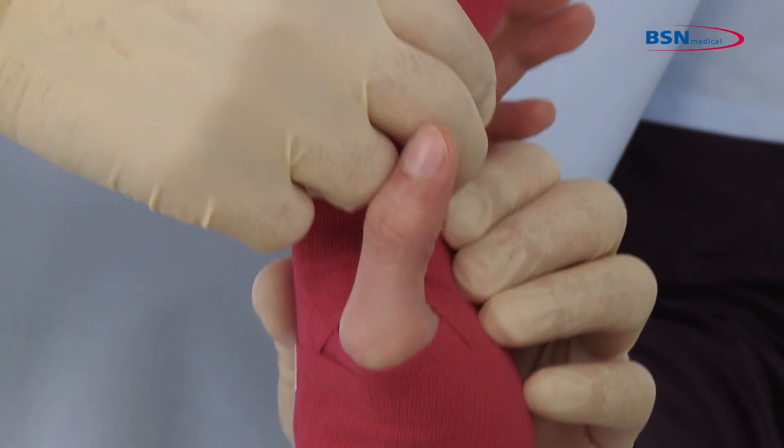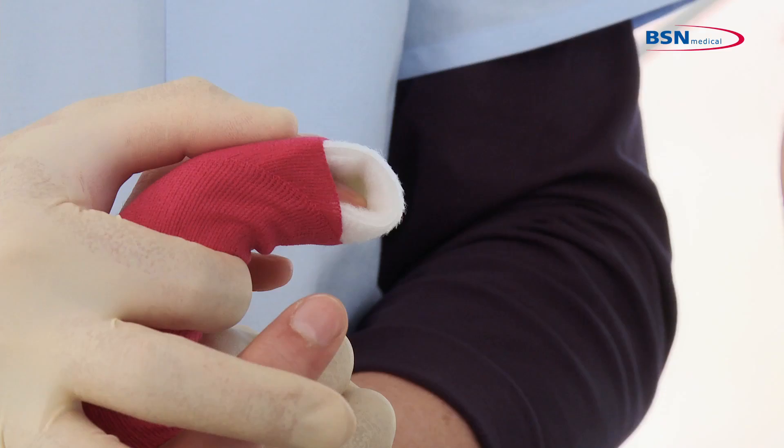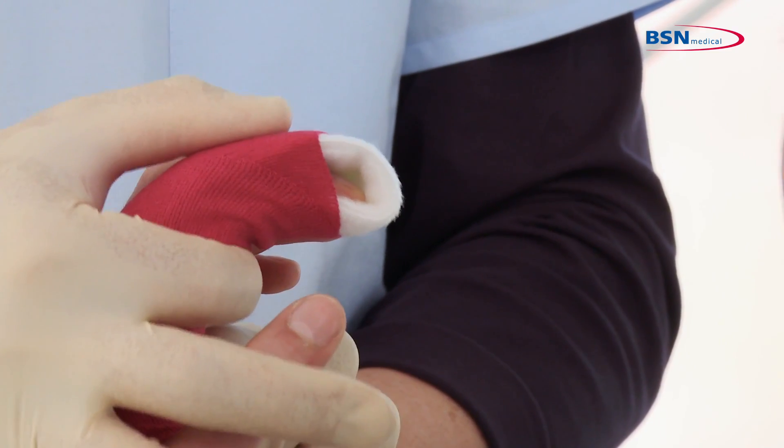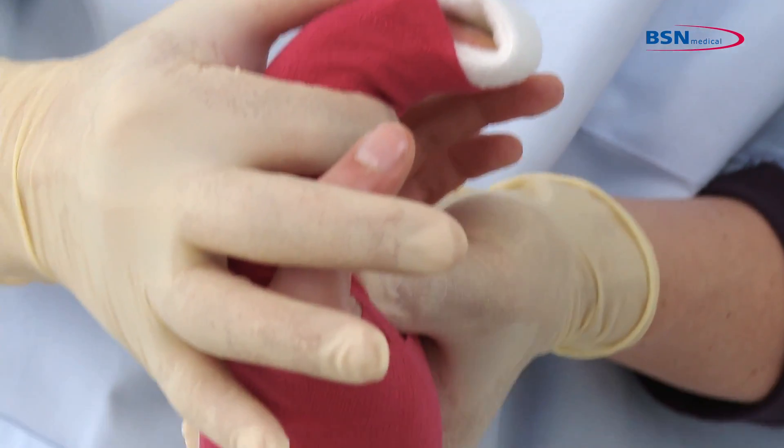Position until the splint is in a rigid position and mold as prescribed by the physician. Please be aware to make sure wrist flexion is possible if the wrist is not involved.